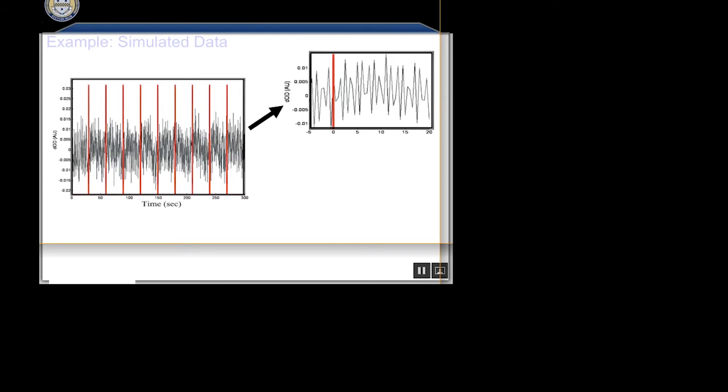This is just an example. This is simulated data. This was actually from the original Homer. So if you download Homer, I think this is one of the data sets that's in it. But you have data here that's heavily corrupted by cardiac and respiratory and stuff. You have these different blocks which are an event. If you just average through, you get something that's really, really noisy, right?